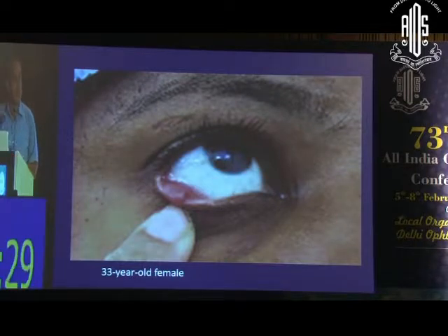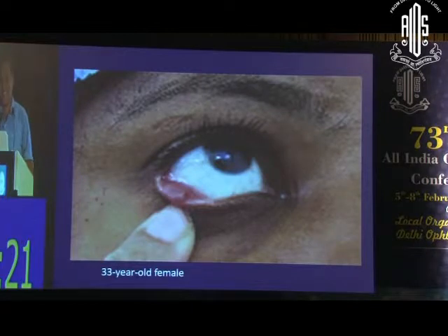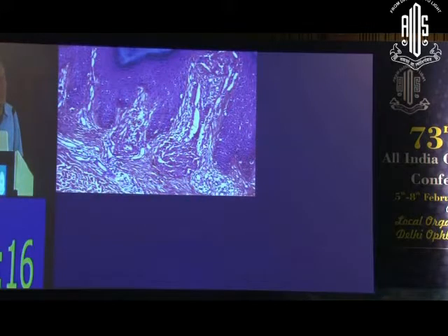Chalazion? Okay, what would you want to do? Excise it and throw in the dustbin. Okay, you want to send it to me. Fine. Let's see what I found.